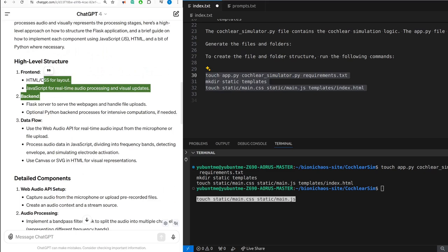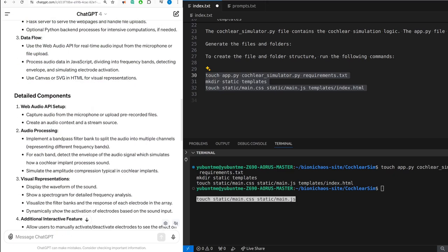Detailed components. 1. Web Audio API setup: capture audio from the microphone or upload pre-recorded files. Create an audio context and a stream source. 2. Audio processing: implement a bandpass filter bank to split the audio into multiple channels, representing different frequency bands. For each band, detect the envelope of the audio signal, which simulates how a cochlear implant processes sound. Simulate the amplitude compression typical in cochlear implants. Visual representations: display the waveform of the sound.